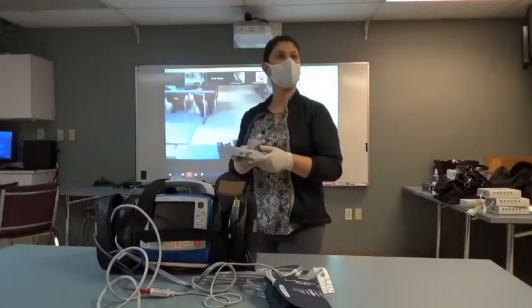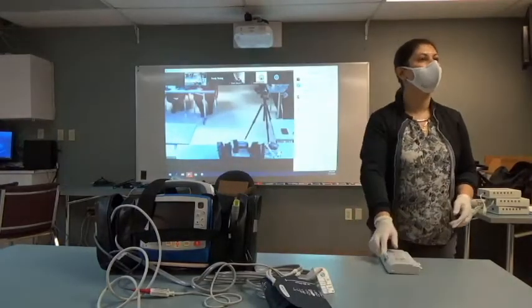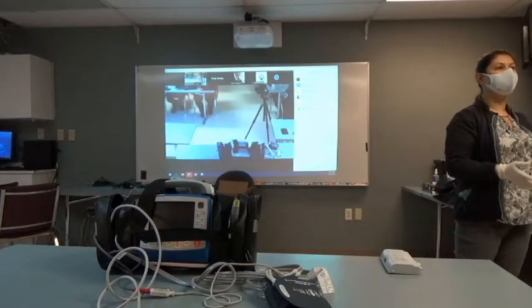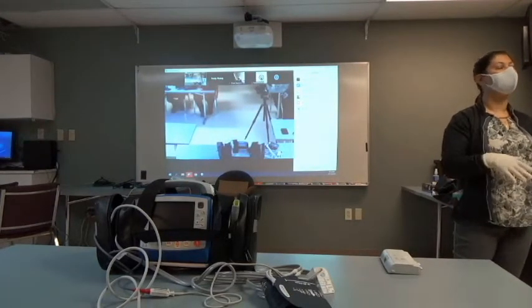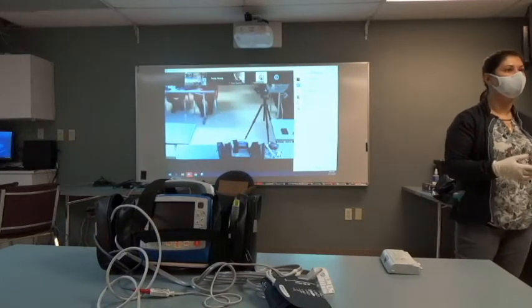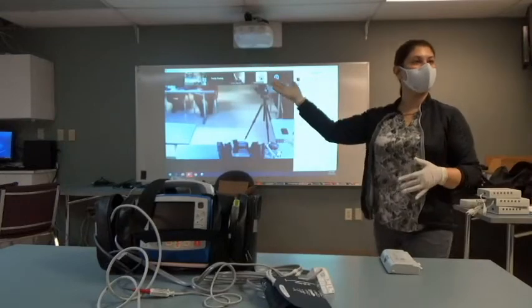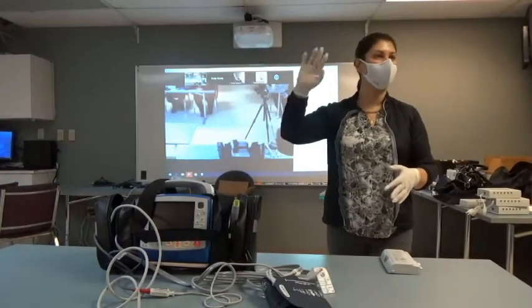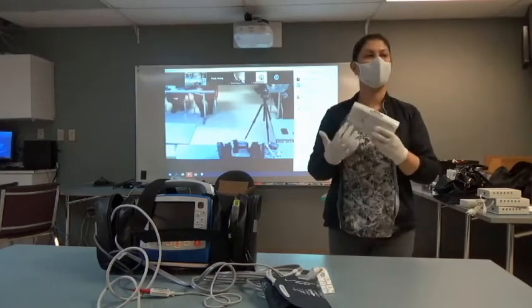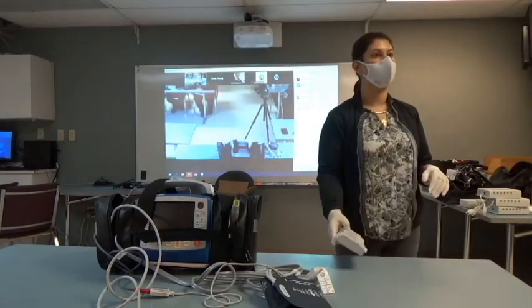Okay. You said they need to be calibrated or reconditioned every so often? Just place it into the base charger, and it will handle the recondition if necessary. It's a smart battery, so if it needs it, it'll do it. But if it just sits on a shelf somewhere and we're like, oh, it's full, no problem, and it never has an opportunity to get a recondition, that's where it could become a problem down the road.